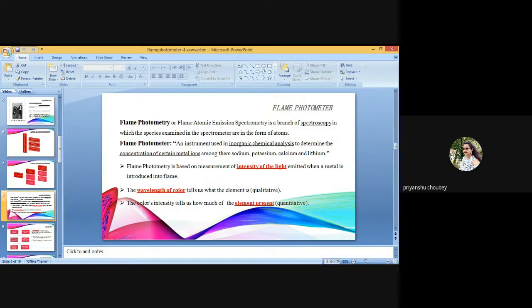These are designed to offer automatic simulation of operations used in a manual procedure for the estimation of an element on the conveyor belt principle. Normally, the same reagents which are used in a manual assay are used in the auto analyzer also.